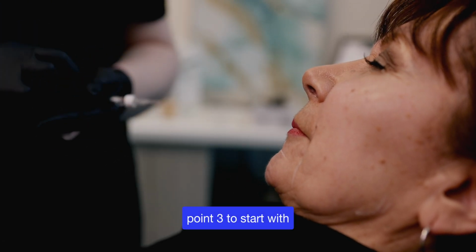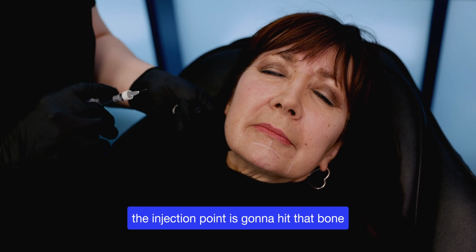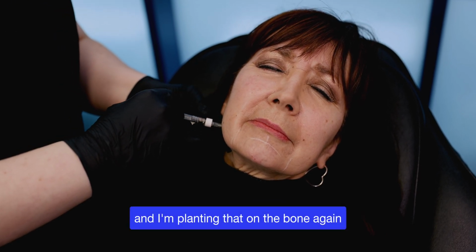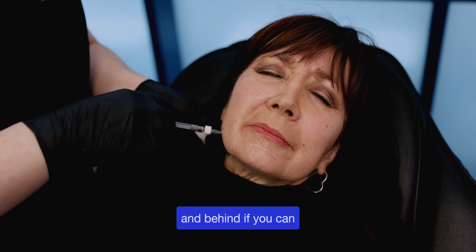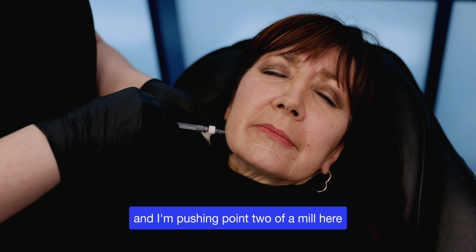0.3 to start with. So I'm going to feel for the corner of the bone to make sure that the injection point is going to hit that bone and not go past it or miss it. I'm going in at 90 degrees, so sharp scratch again, Miriam. And I'm planting that on the bone again. Good aspiration. And you want to support that filler underneath the jaw and behind if you can to stop it dropping. And I'm pushing 0.2 of a mil here.